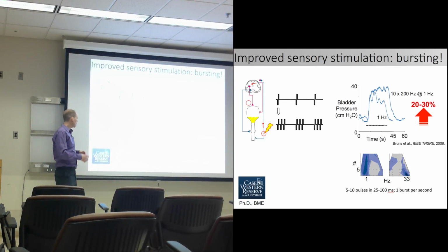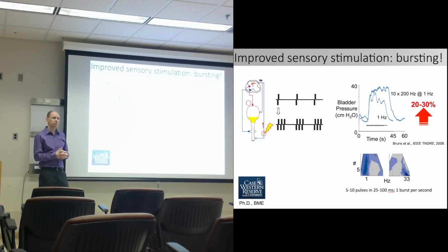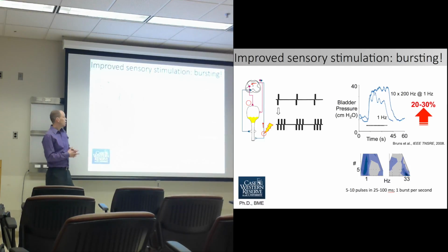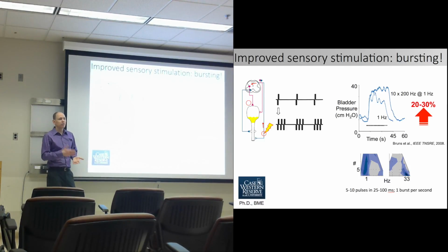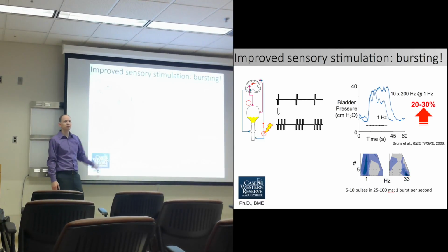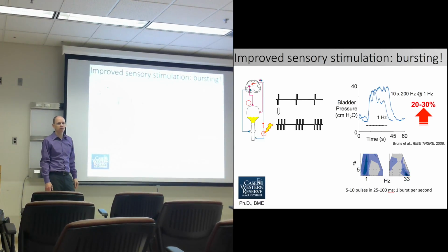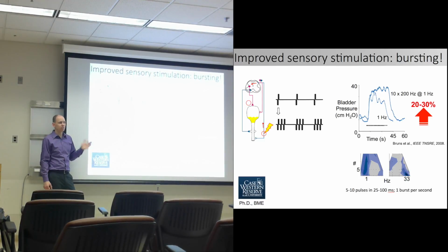When I did my PhD at Case Western, the primary thing I focused on was to stimulate the dorsal nerve and try to get better reflex bladder contractions for a patient with a damaged bladder. In general, the stimulation pulses that we use are kind of like a hammer: just hit the nerve with something hard and try to get some output activity. The stim device I mentioned before has a 15 or 20 hertz continuous stimulation. That can work great if you're trying to drive muscles to respond to the pattern of stimulation.